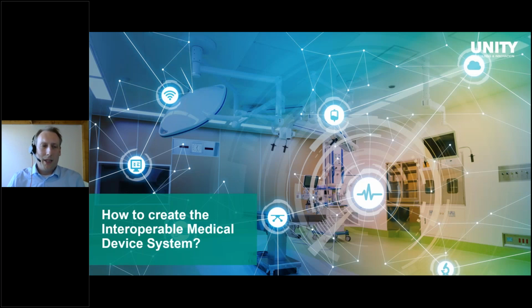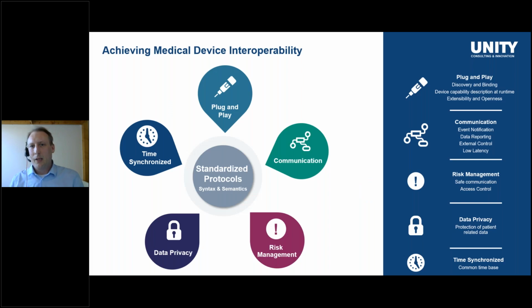So what I would like to discuss with you now is how do we achieve medical device interoperability and what are the key topics that need to be addressed. Before we look at how we can integrate our devices in such a system, I would like to address the key topics. First and foremost, our device A would benefit from a protocol with a standardized syntax and semantics so that our device can easily make use of the data and maybe implement a safe control user interface.